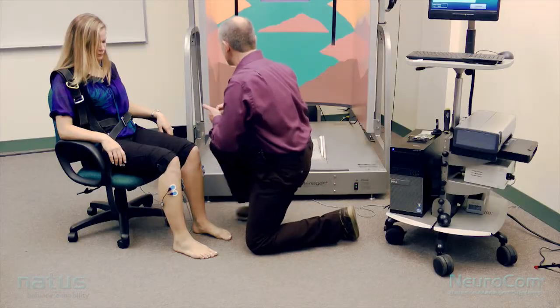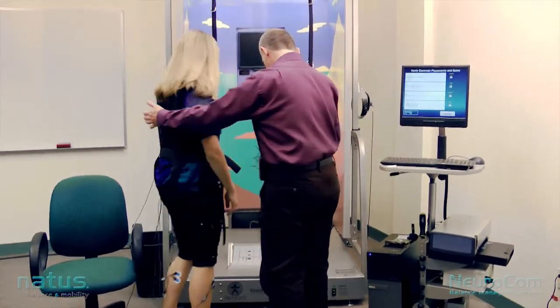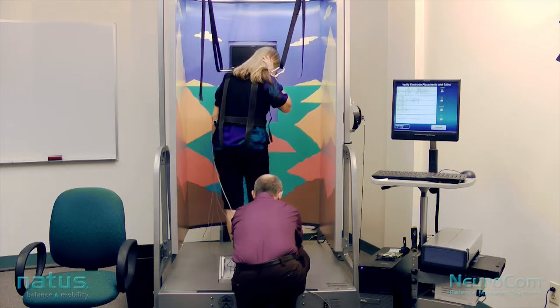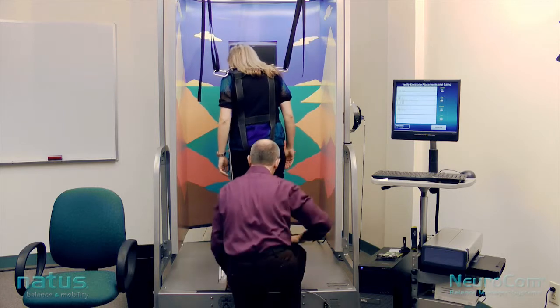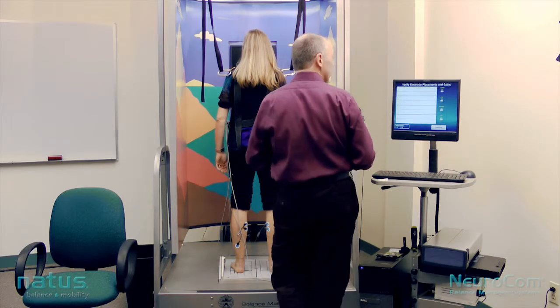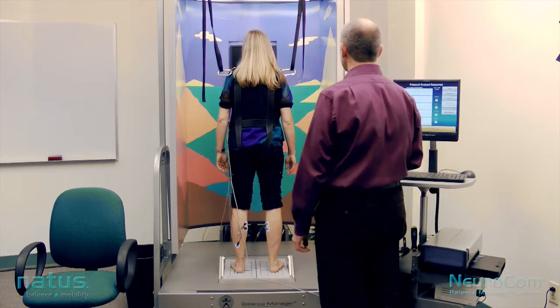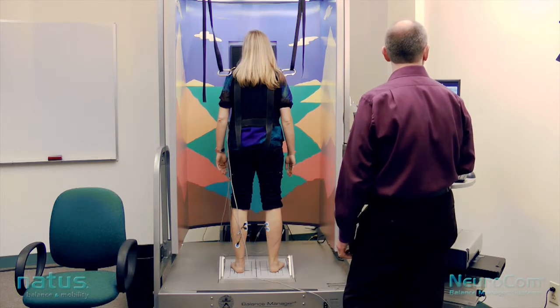The trickiest part is the transfer from sitting, because you've got all these wires to manage. Have the patient stand up, step up on the platform facing the scenery with standard foot placement. After all this preparation is done, the test itself is quite simple. The patient will feel 20 rapid toes-up tilts — eyes open or closed doesn't really matter — and they should just relax and think about standing as steadily as they can.